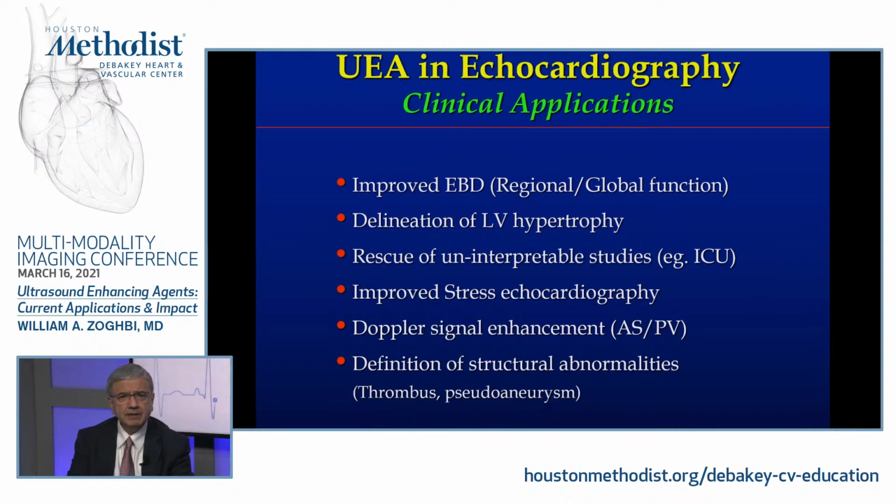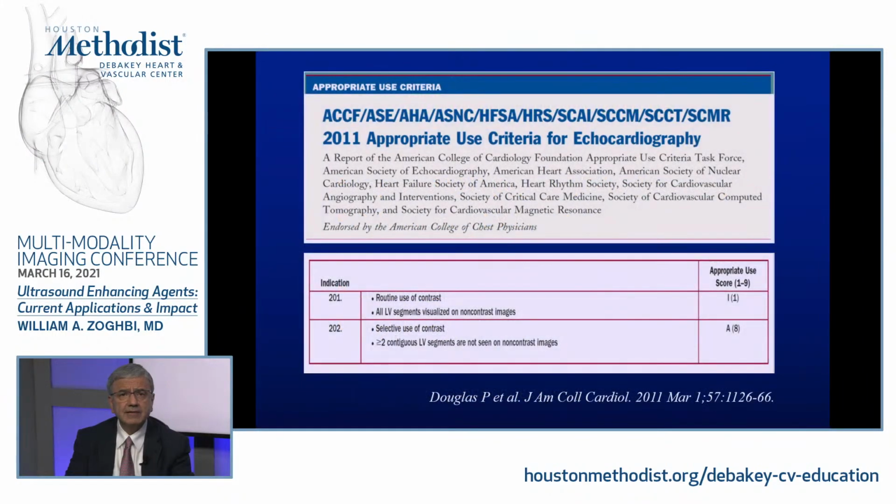Doppler enhancement and definition at times of structural abnormality. If you're really not sure that there's a thrombus or a connection between the ventricle and a sac with maybe a pseudoaneurysm, I think these are very helpful utilizations of ultrasound enhancing agents.